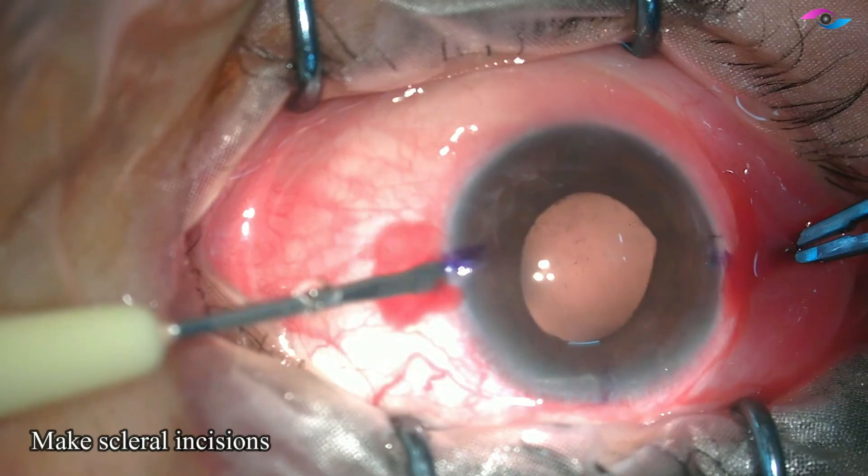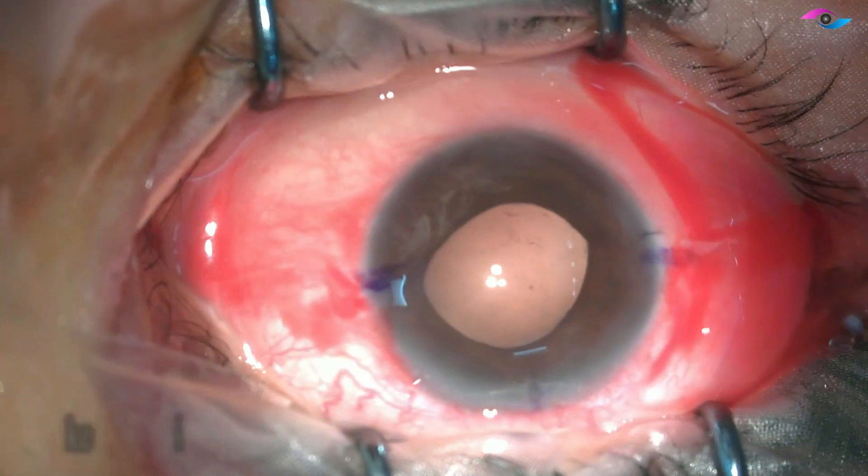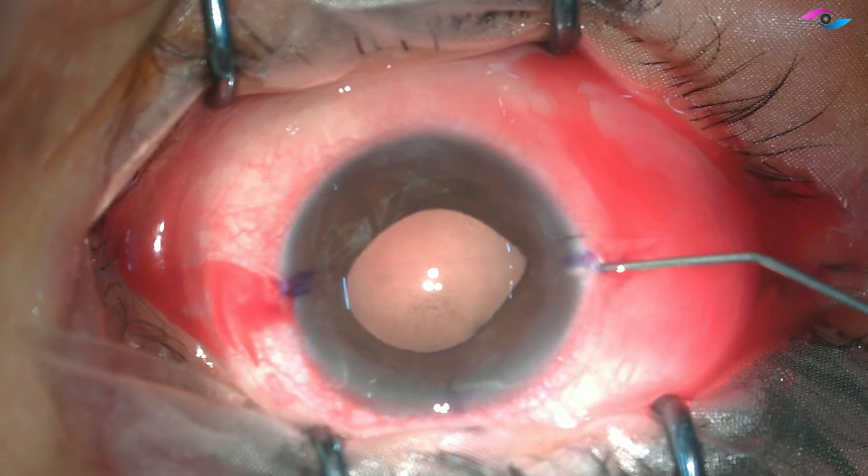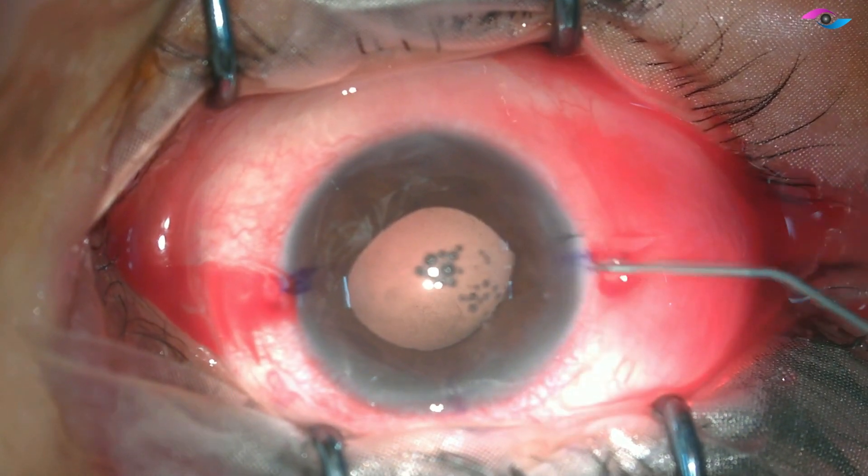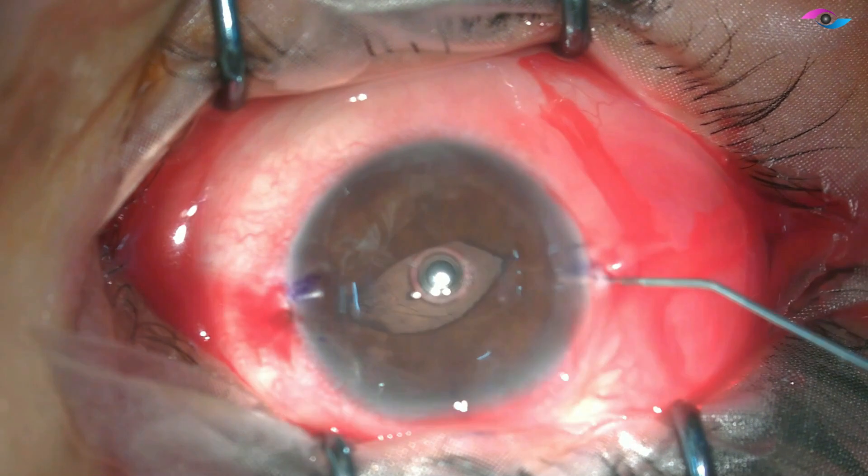The first tip is to mark these incisions 180 degrees apart and to make scleral incisions instead of limbal. This helps in avoiding the cat's eye reflex which might be seen with these IOLs.